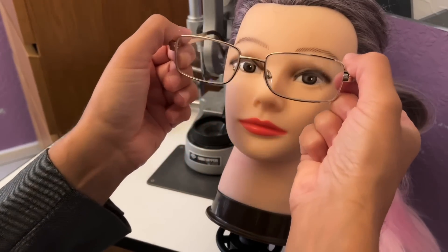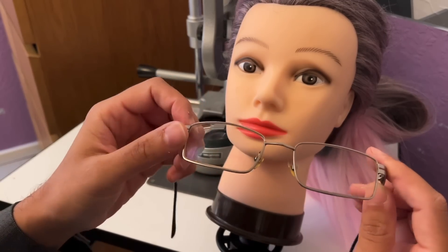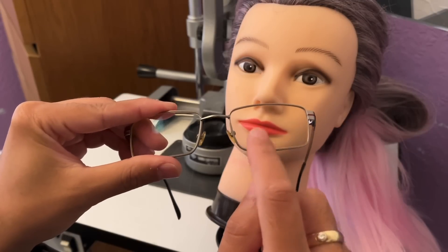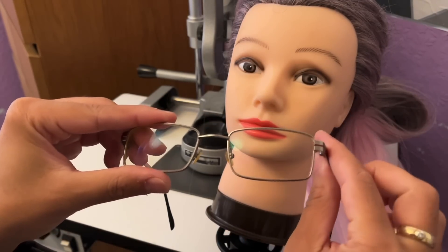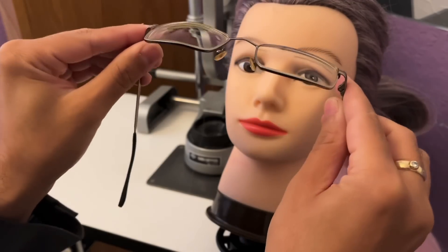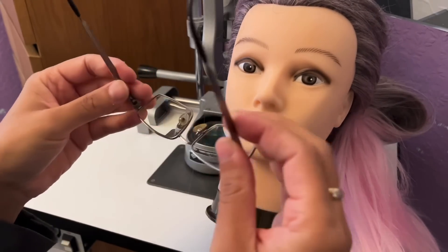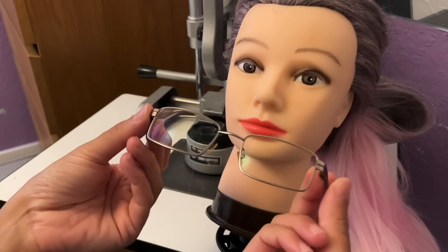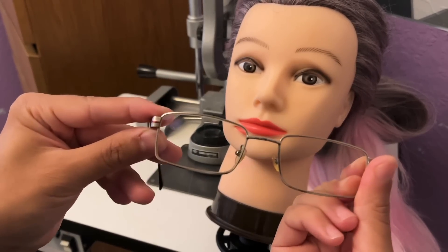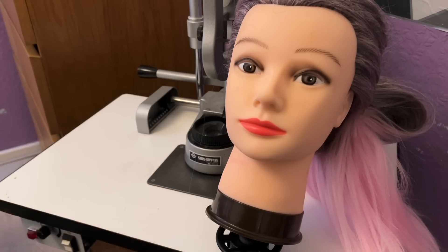So we have four options. If you went for something like this, because you've been used to bifocals, we could certainly put a varifocal lens into the frame for you to try. Varifocals allow you to see far, intermediate, and near, but of course there's no segment on the bottom of the lens — it looks completely clear, with your prescription blended into those lenses. You could still have the anti-reflection coating or a react-to-light lens in your prescription. Varifocals may give you that little bit more of an option with the intermediate work that you do.